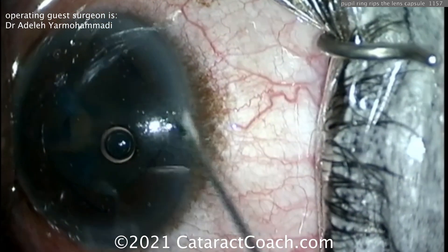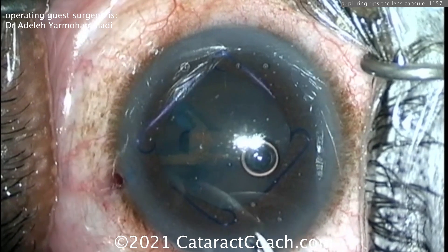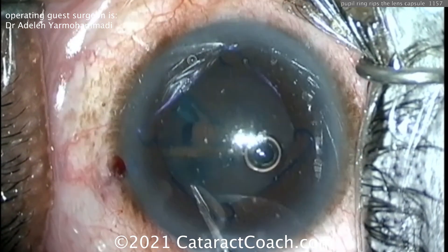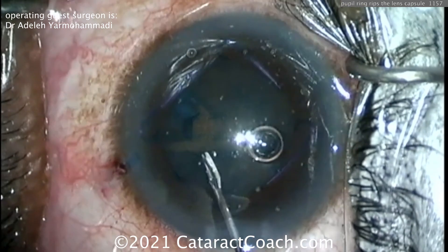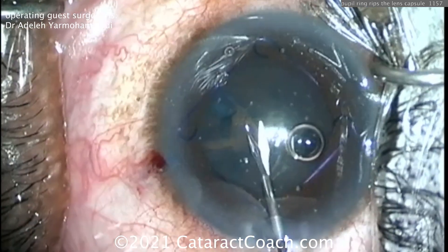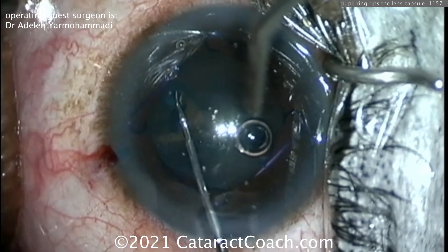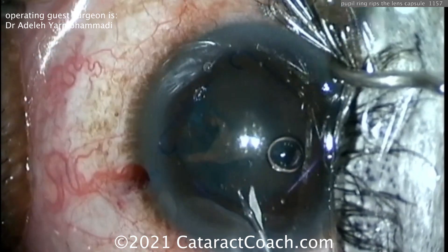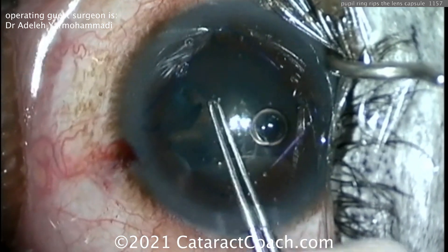Maybe just finish the rhexis in the other direction — and micro scissors are now going into the eye. You can go distal past the break, cut the capsule, and then finish the rest of the rhexis. You can grab that cut area to make a flap and do a clockwise capsulorrhexis for the remaining ten clock hours. I'm watching the scissors go in — going past the rip area and making a cut in the capsule. That's great — I like that approach.